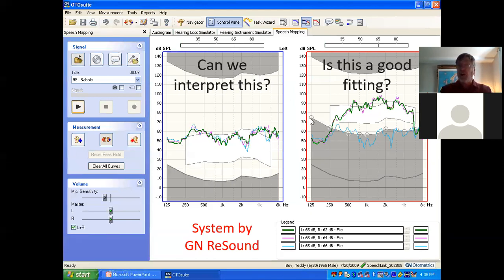When you're looking at the hearing loss, it's a flat hearing loss. It's got to be because this line here is minimal audible pressure and on the audiogram it's 0 dBHL. So these thresholds here, what would they be? If this is 75 at 250 and this is 25 at 250, the difference between 75 and 25 is 50. So all we've done is bank in a flat 50 dB hearing loss. So this person's thresholds look just like MAP. They're just lifted up by 50 dB. And now you've measured what the hearing aid's doing.